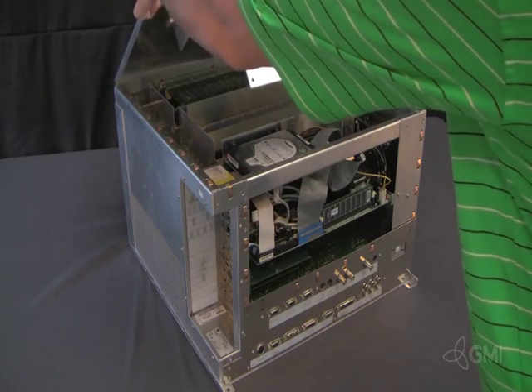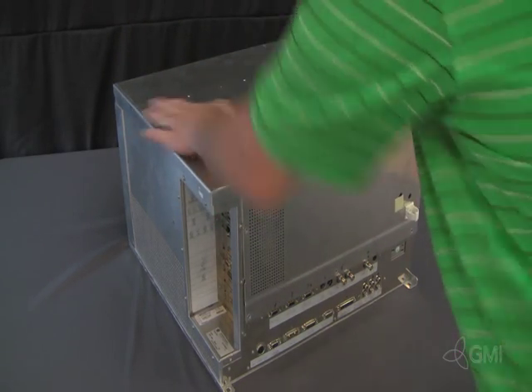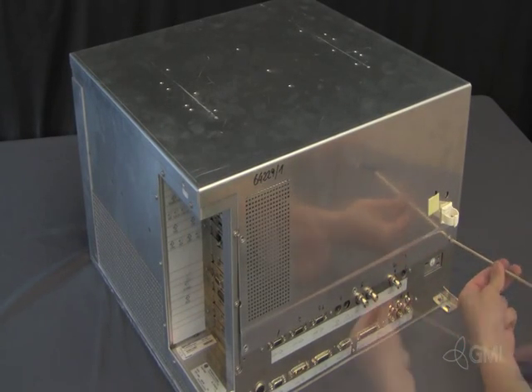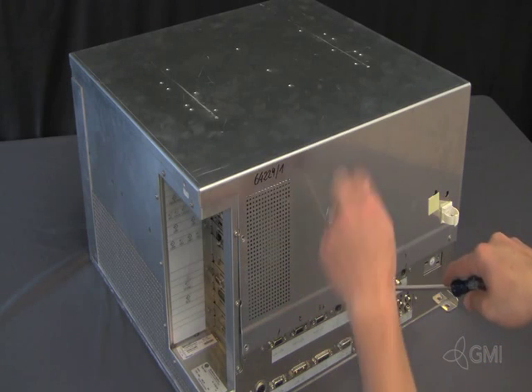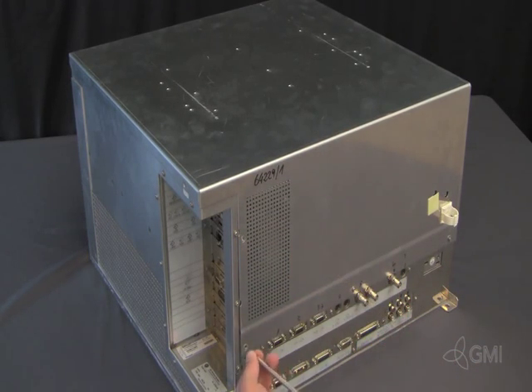Replace the e-box cover. Reinstall the eight screws to secure the cover. Replace the DB5F.